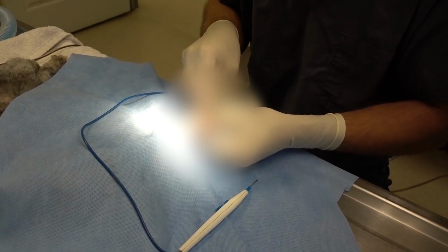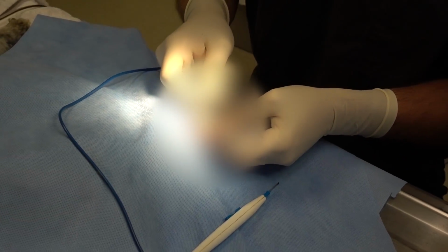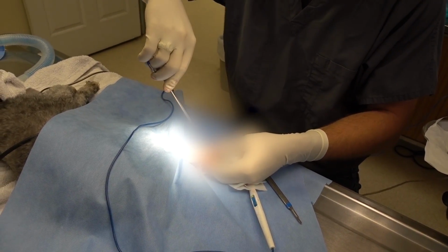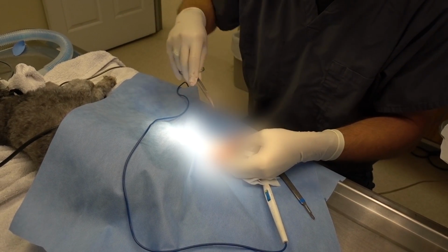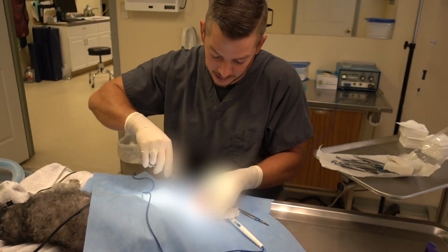I'm gonna make a total 360 around this thing on the skin where I want it, and then I'll go start dissecting through and looking for big vessels. So I've completely gone around with the skin. Right now I'm doing what's called blunt dissection, and basically I'm going in with these scissors and I'm opening up like that, and it's just stretching and kind of ripping instead of cutting. Like I could get a scalpel and just cut this thing off, but if there's any big vessels in there, it'll just chop in half and they'll bleed like crazy.